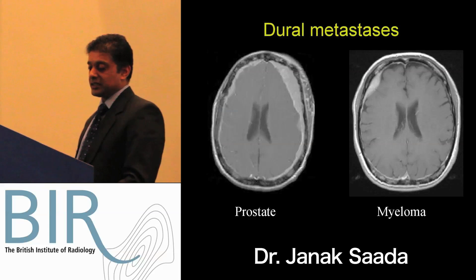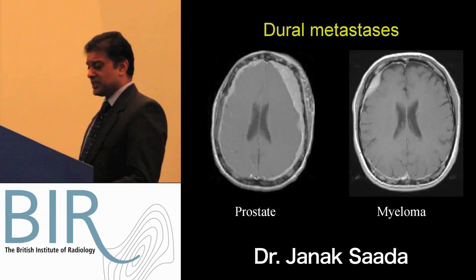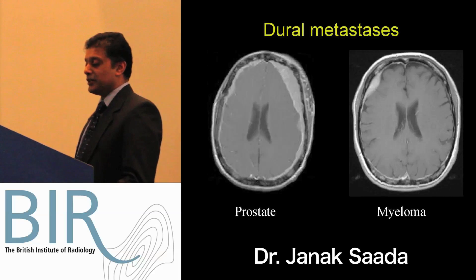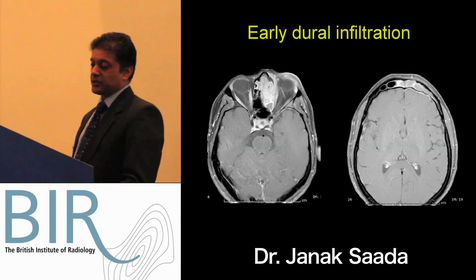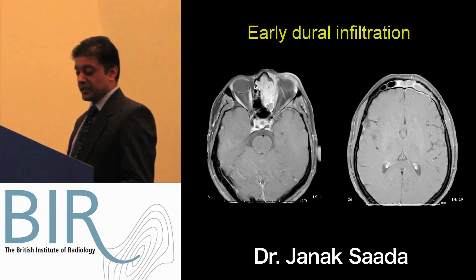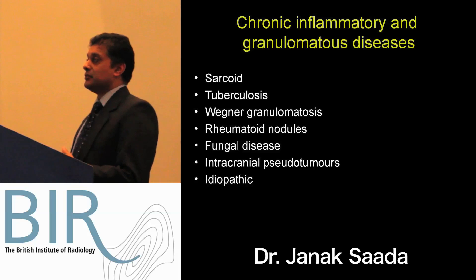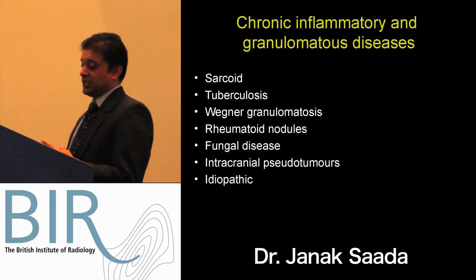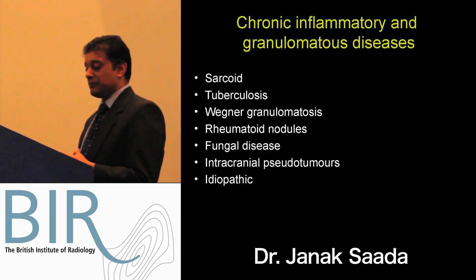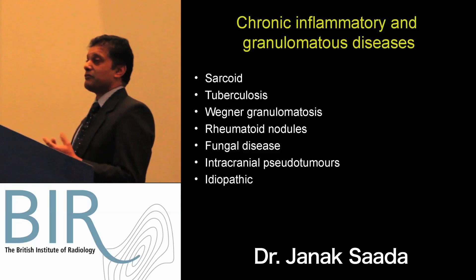This patient has an ethmoid sinus malignancy - actually a melanoma extended through the anterior skull base and into the orbit. On a higher section, there is very early dural enhancement which may be an important indicator of intracranial involvement, particularly when considering radical craniofacial surgery. Conditions like sarcoid, TB, and Wegener's granulomatosis can manifest with dural thickening - sometimes relatively localised and smooth, other times large dural masses. Some manifestations of these granulomatous diseases extend beyond the dura, and you can also have leptomeningeal disease and vascular involvement with vasculitis altering the overall appearance.